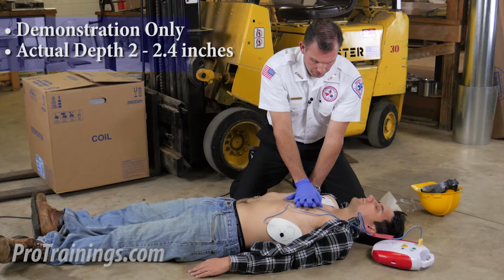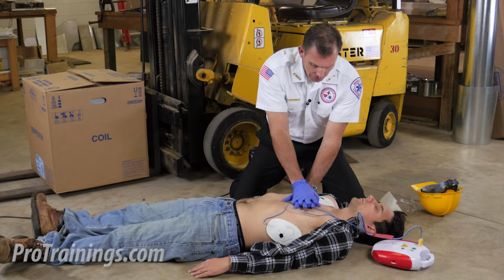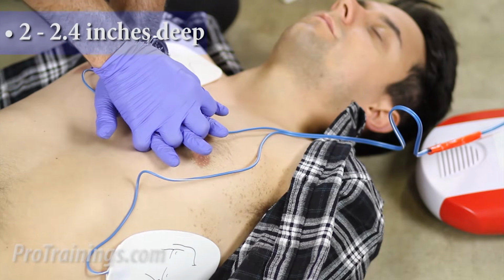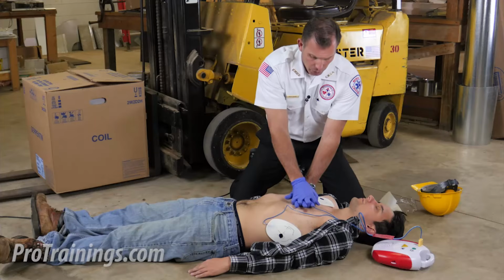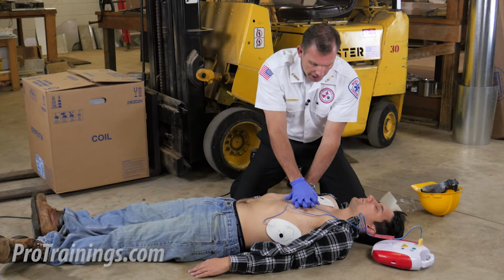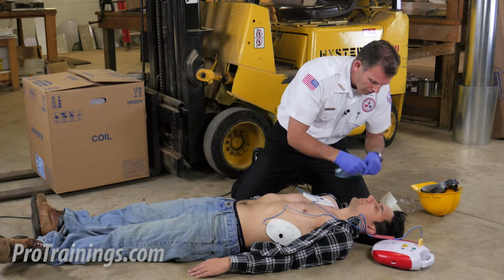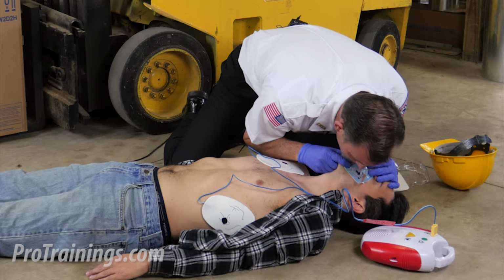Begin 5 cycles of CPR. 1 and 2 and 3 and 4 and 5 and 6 and 7 and 8, 9 and 10, 11, 12, 13, 14, 15, 16, 17, 18, 19, 20, 21, 22, 23, 24, 25, 26, 27, 28, 29, 30. I grab my rescue shield with a one-way valve, pinch the nose, tilt the head back, and give 2 breaths.